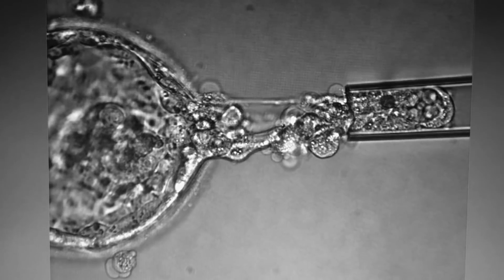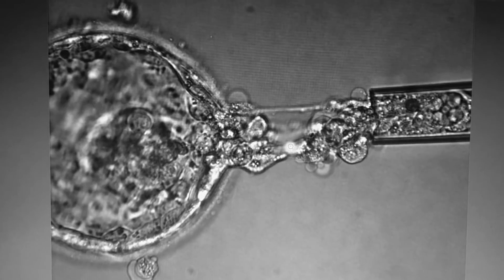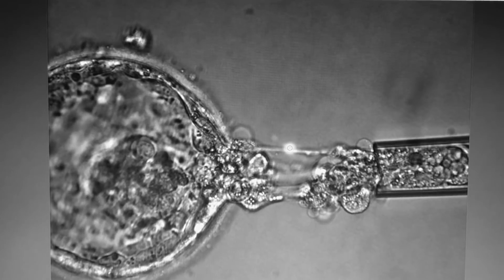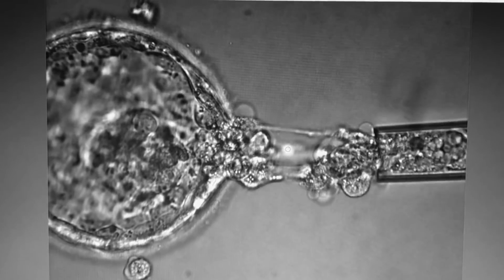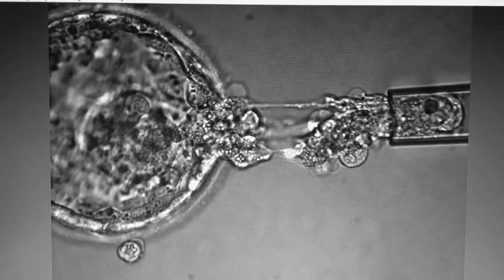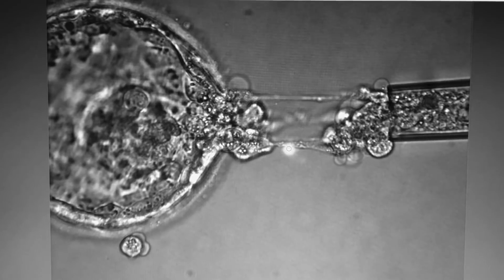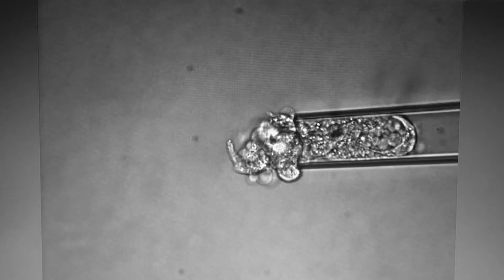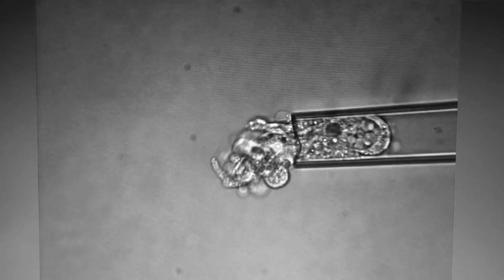This is a real-time video of the trophectoderm biopsy. You can notice that this needs adequate skills and expertise to perform, and if done correctly, it can be done without causing any damage to the embryo within a span of approximately 2 minutes. The cells which have been aspirated are then sent for further examination and analysis.